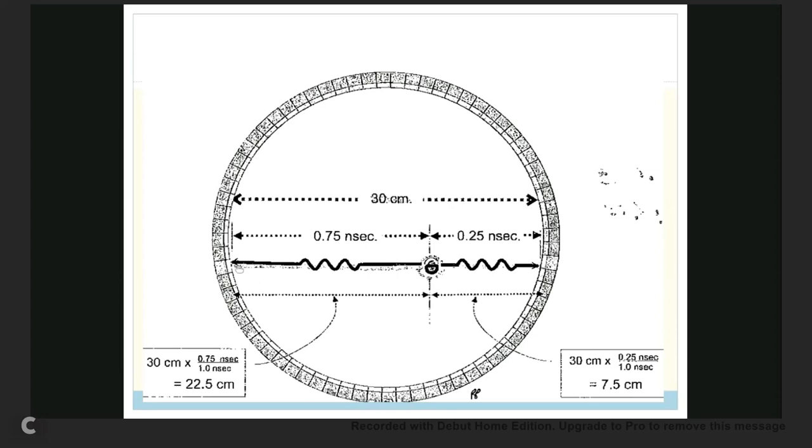Not that it won't accept the resolution here, but it's not going to be as accurate as this one. So ideally what you want is for it to be from here and then both trying to get there almost at the same time, if that makes sense. The one that gets to the detector first is the information that's being registered for resolution.